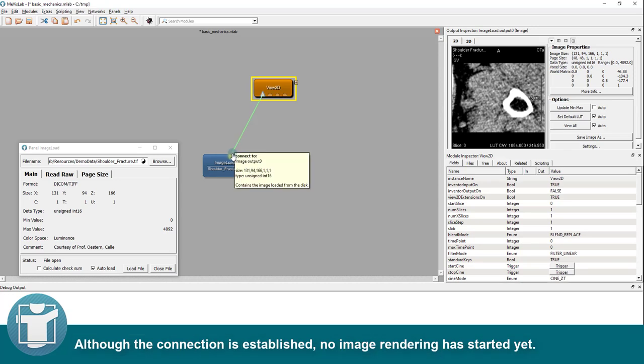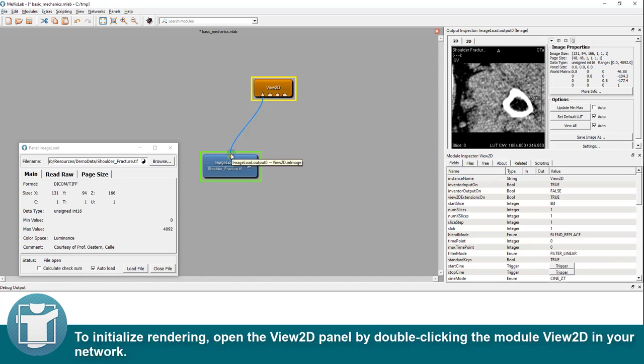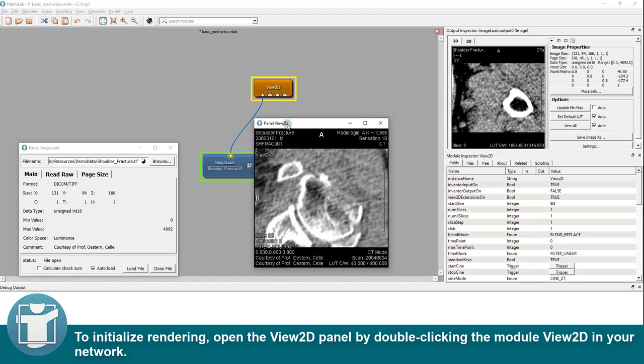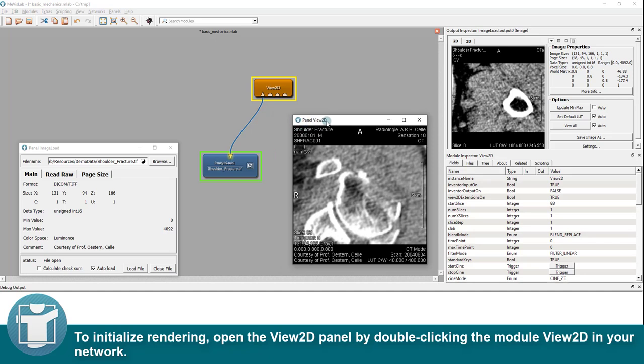Although the connection is established, no image rendering has started yet. To initialize rendering, open the view 2D panel by double-clicking the module view 2D in your network.